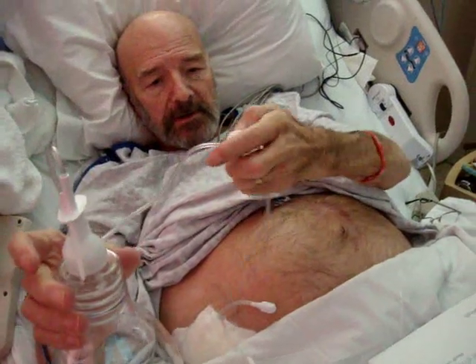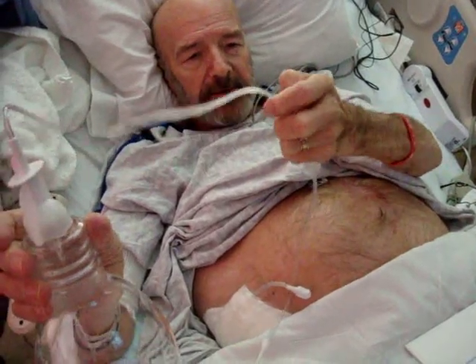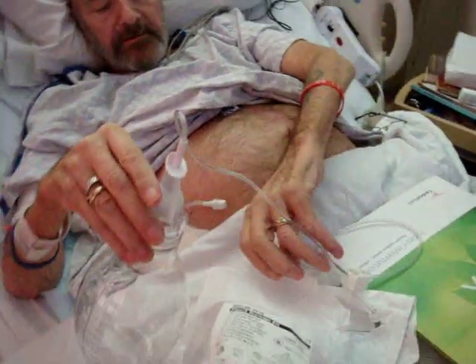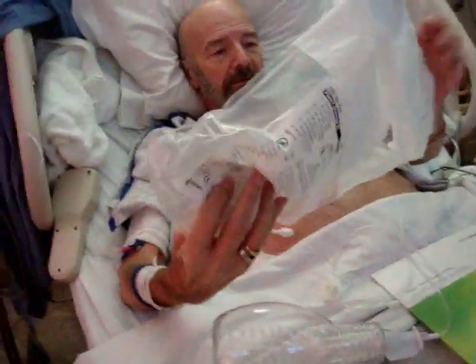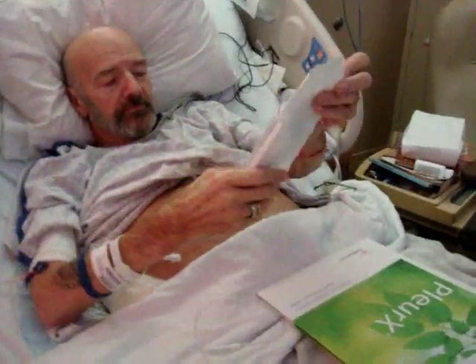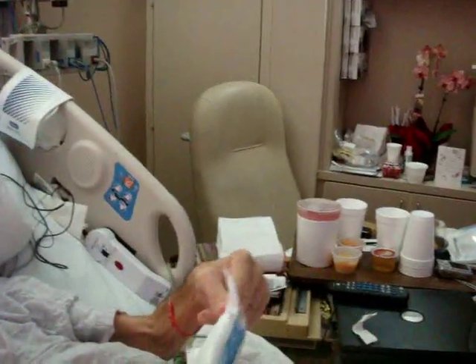So I'm going to take off this, and we close off and control the flow — just to see if that's enough. That is to stop the flow of fluid until we're ready for it. And then we close off, and then we take out the gauze that's in here. We use that for a kind of trash, and keep it nearby. And then we open this — the top end.